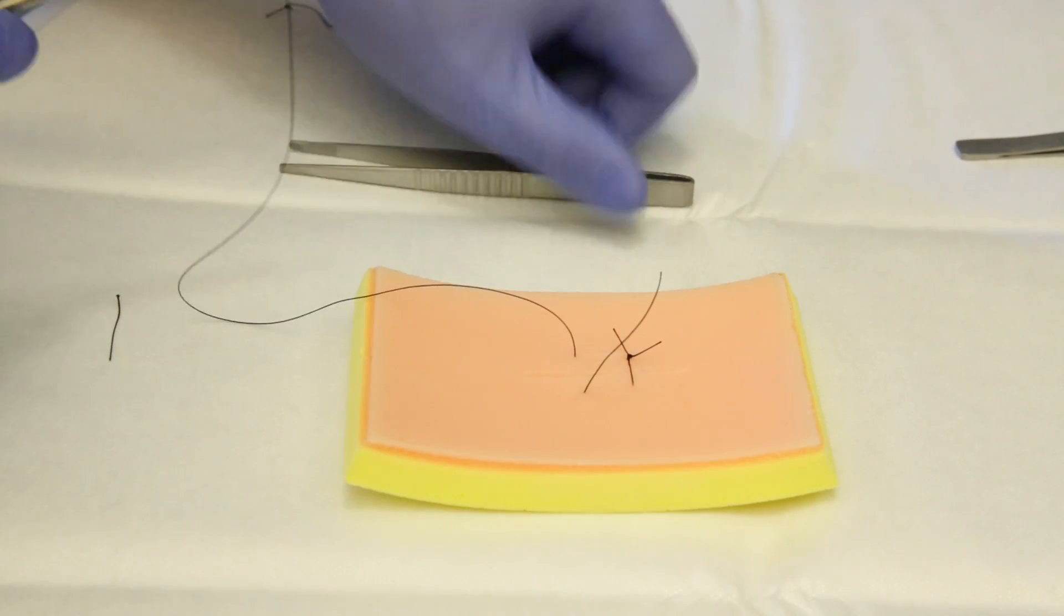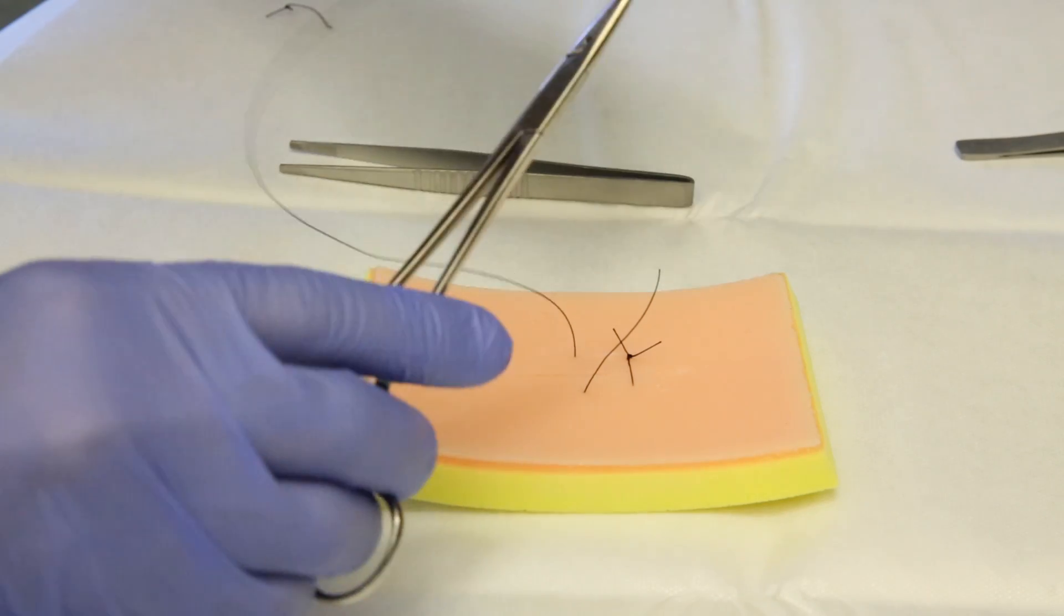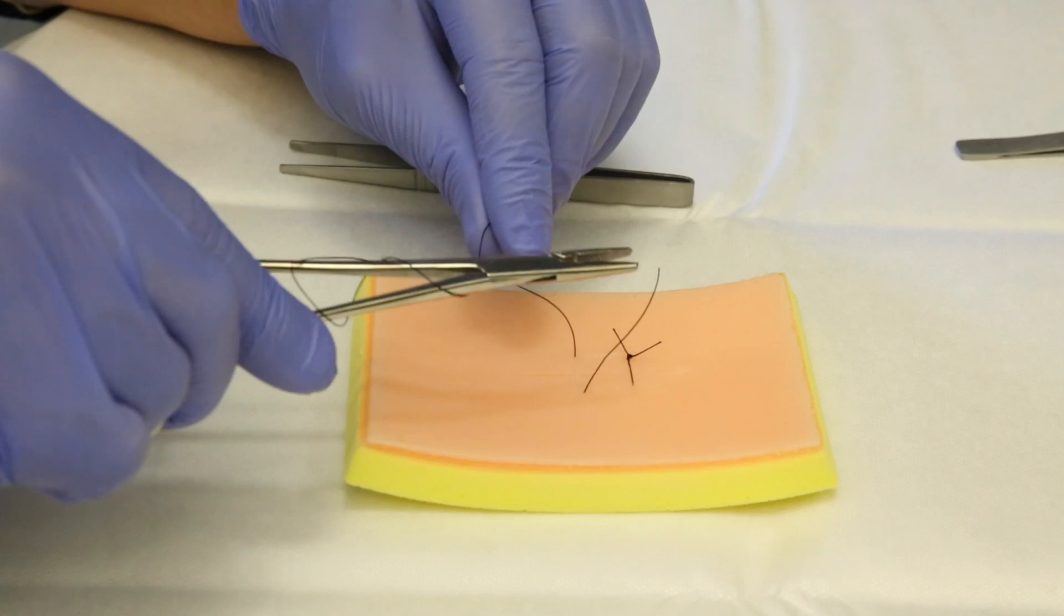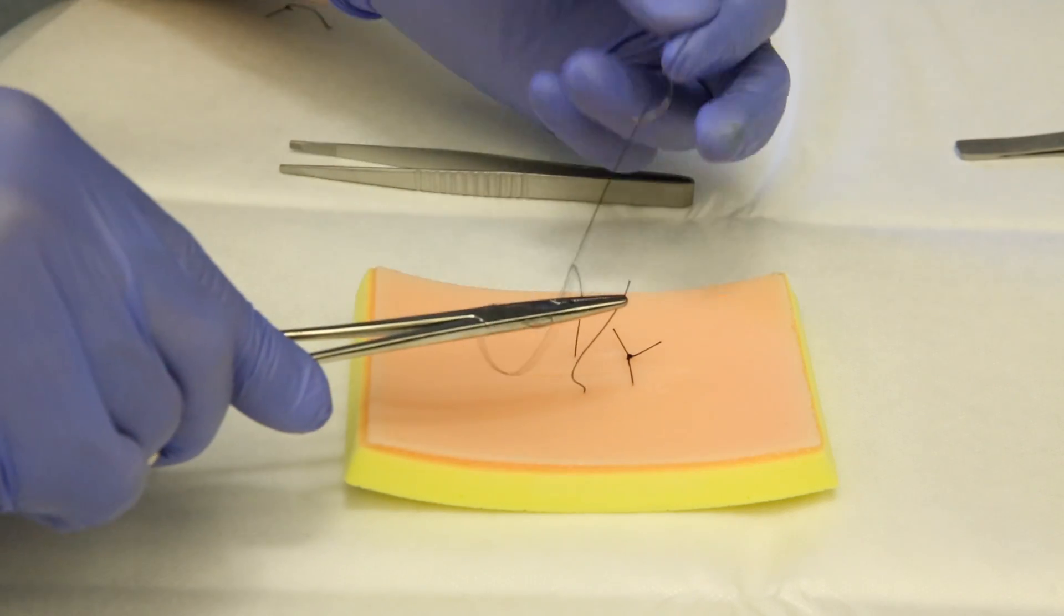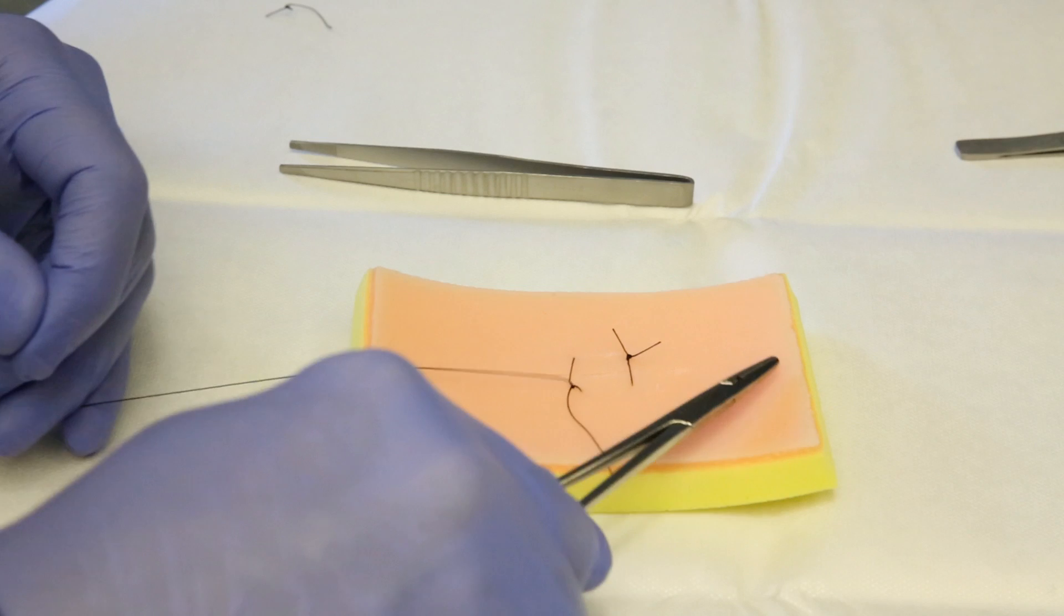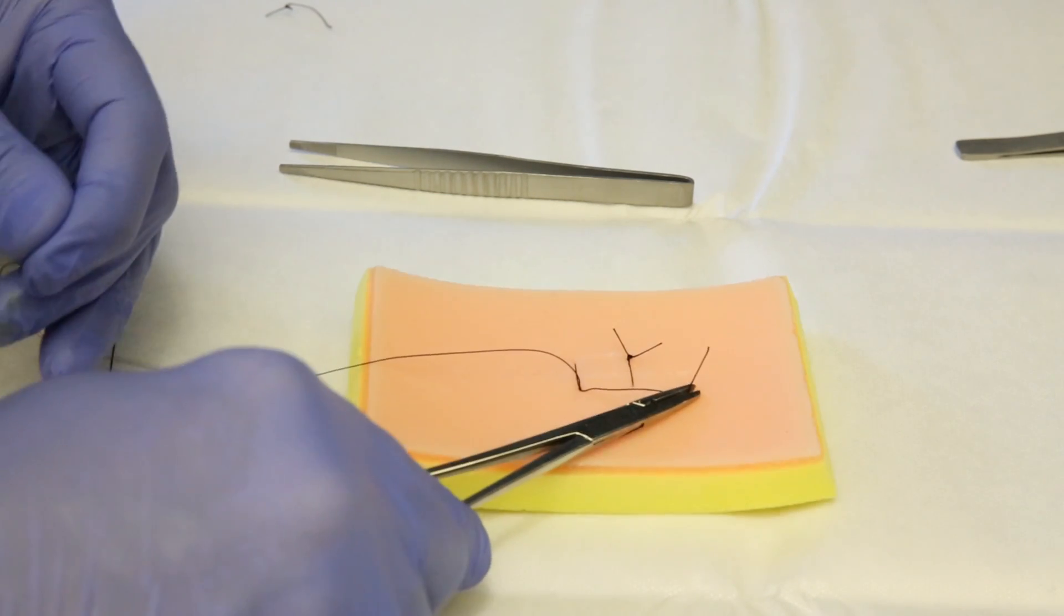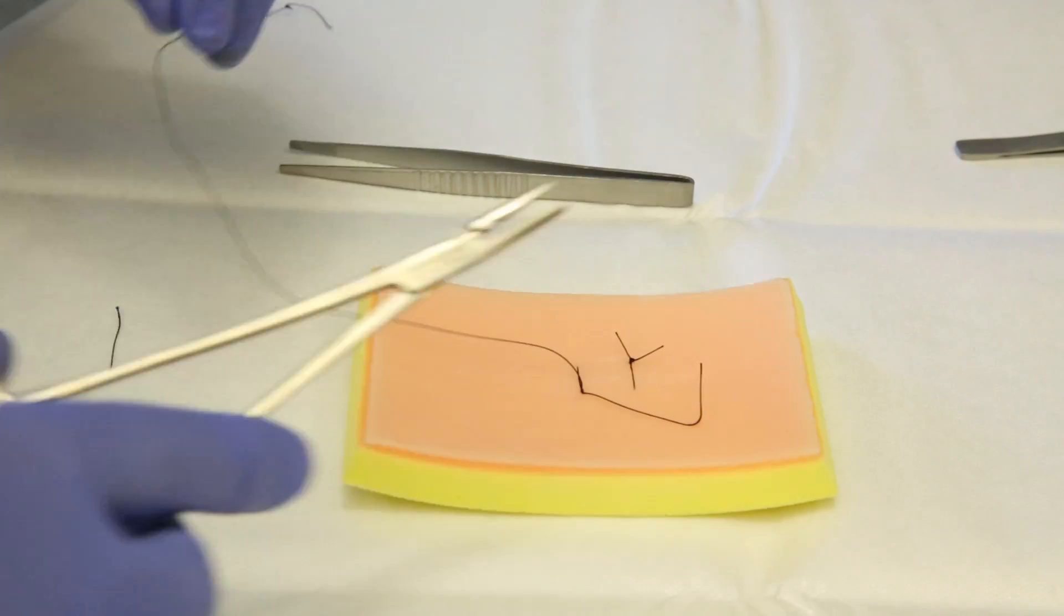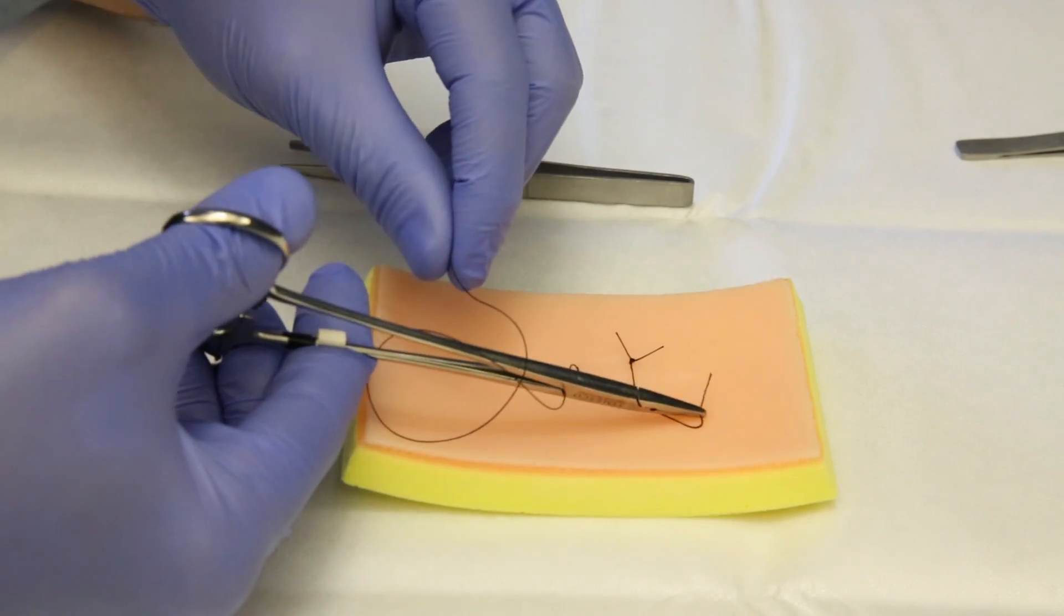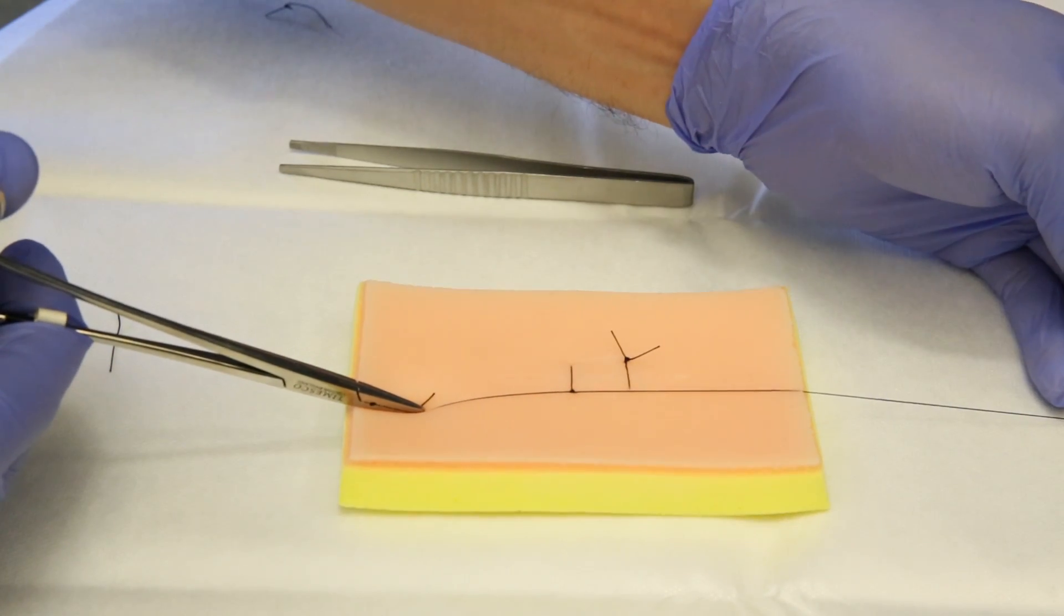The thread now across the wound margin, making the instrument knot to turn around the needle holder, taking the other end, pulling the thread parallel to the wound, repeating it on the opposite side. Making the second knot here.